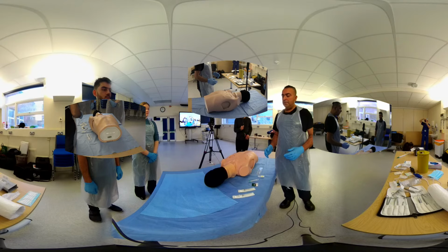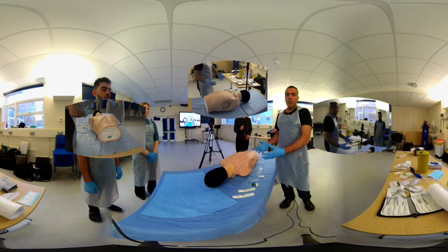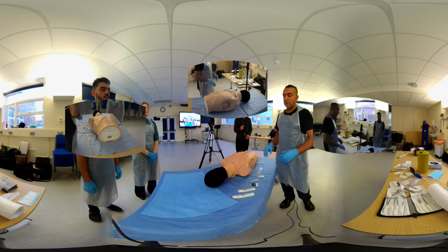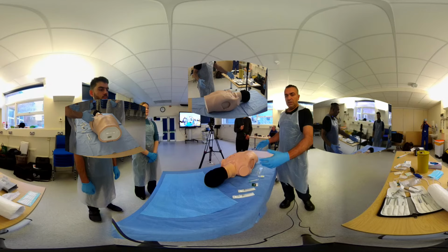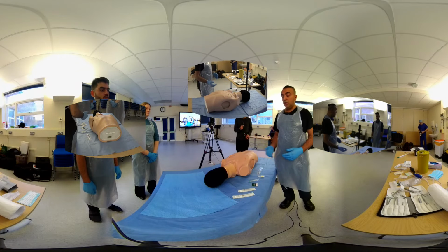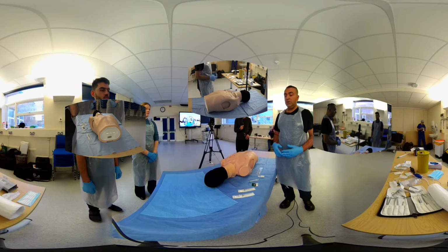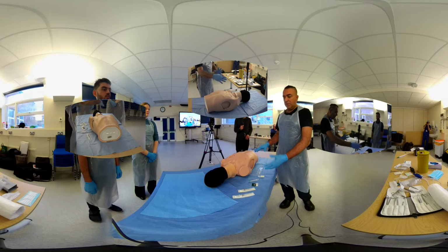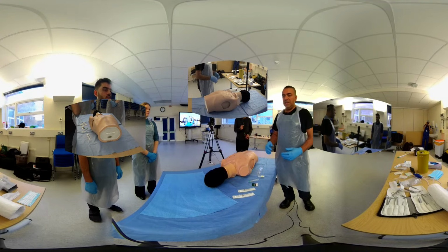In a lecture, you will go through what a tension pneumothorax is and why it's so dangerous, but the treatment of this is critical. This is a simulated patient, supine, in an A&E resus, but this could also be done in pre-hospital care, with the patient in multiple other positions. They may have other injuries going on, but you'd need to treat tension pneumothorax really rapidly.